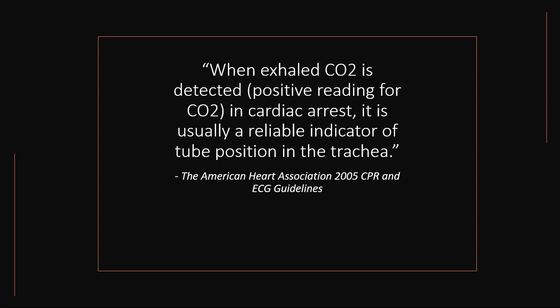The American Heart Association even goes so far. You know how the AHA takes forever to weigh in on anything. Even the AHA says when CO2 is detected in cardiac arrest, it's still a reliable indicator of tube position in the trachea. So even in hypoperfused states, if you're doing compressions and moving blood around, you can get a good end-tidal CO2 waveform.